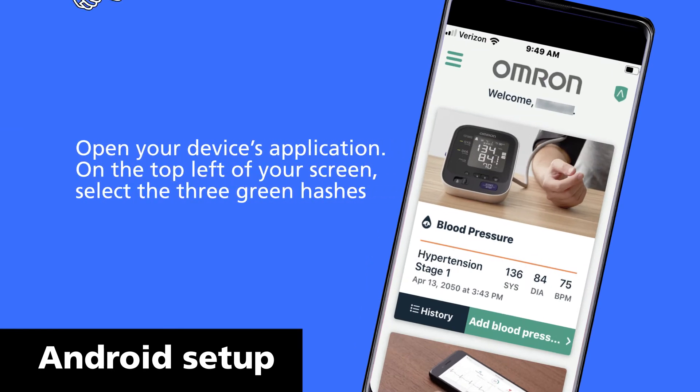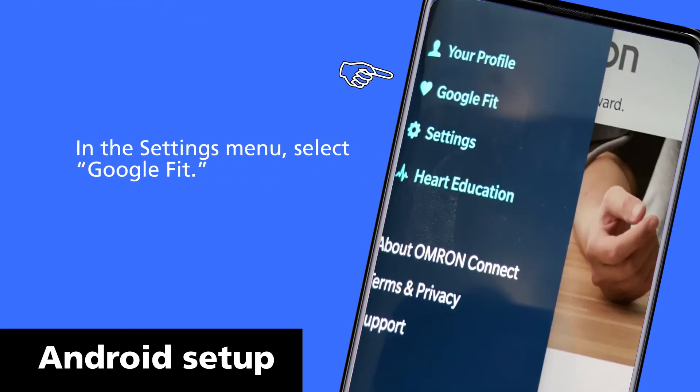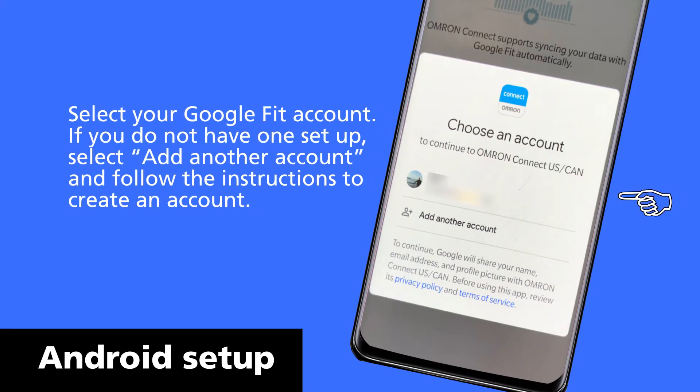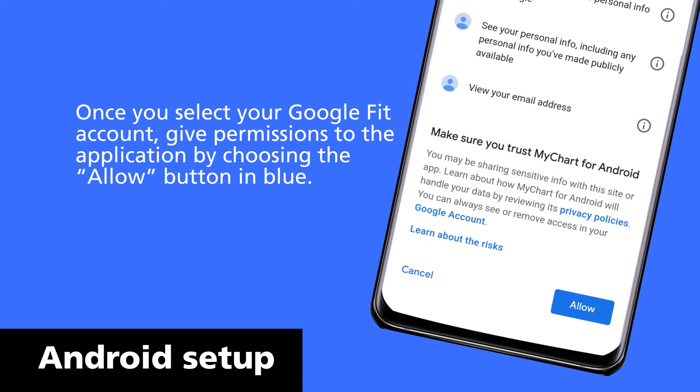Open your device's application. On the top left of your screen, select the three green hashes. In the settings menu, select Google Fit and choose Connect to Google Fit. You'll be prompted to choose an account to connect to your device. Select your Google Fit account. If you do not have one set up, select Add another account and follow the instructions to create an account. Once you select your Google Fit account, grant permissions to the application by choosing the Allow button in blue.